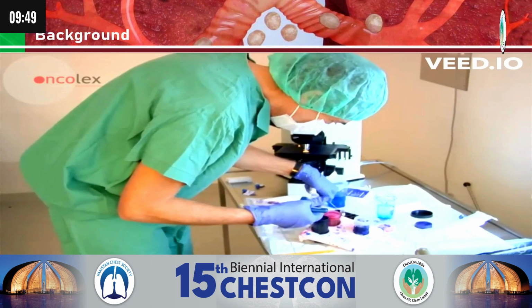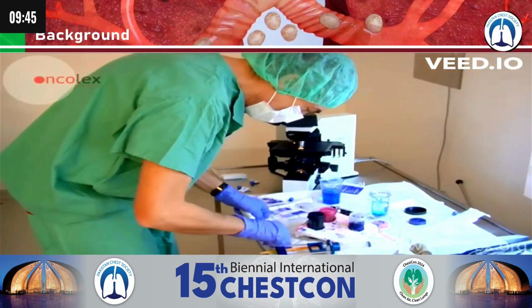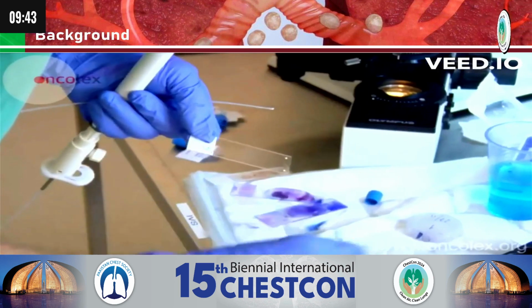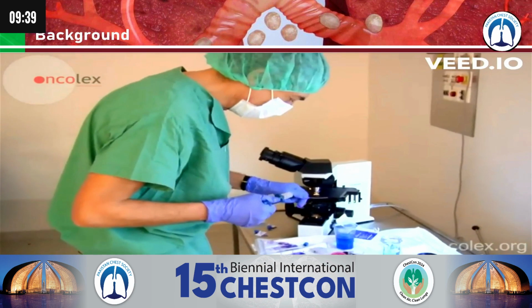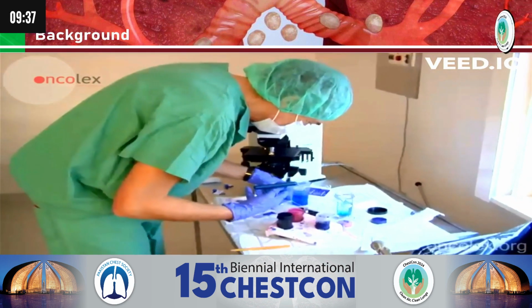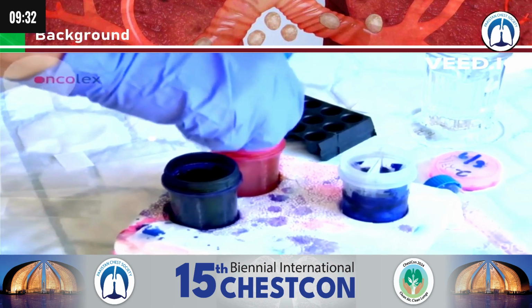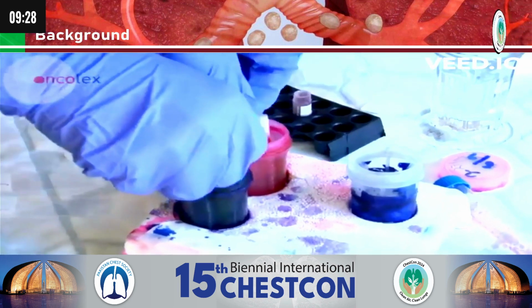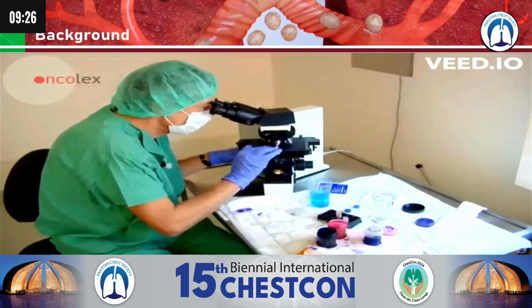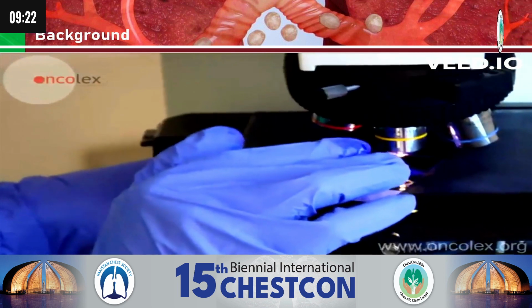After the aspiration, the material is carefully pressed out onto a slide. The material is smeared using another slide. The needle is then rinsed with saline solution. The test material is stained with a rapid stain and immediately examined under a microscope by a pathologist. He checks that there is sufficient material from the lymph node for an analysis.